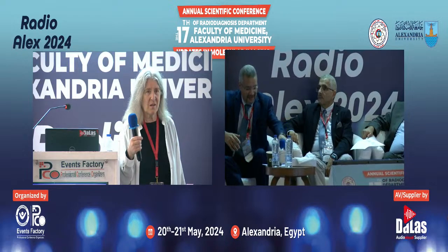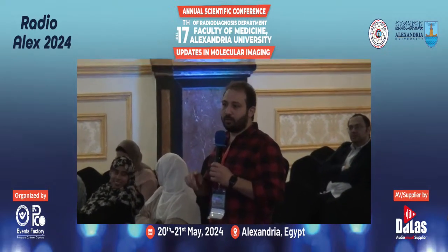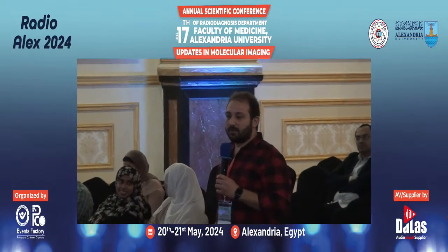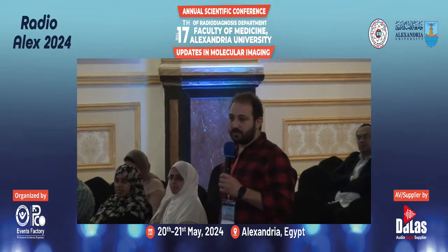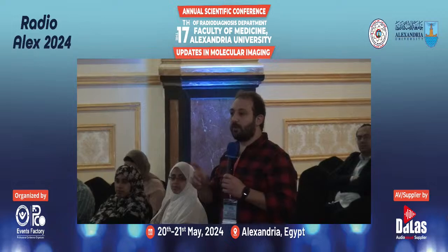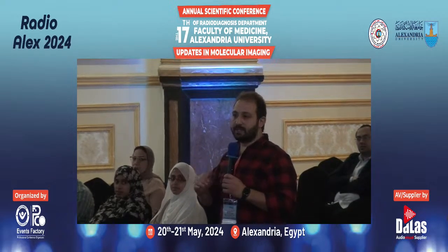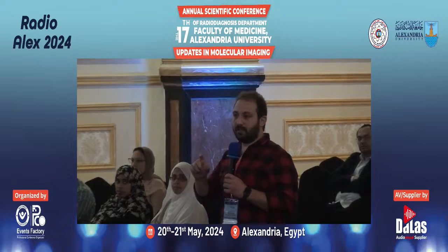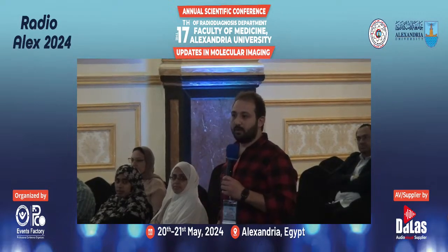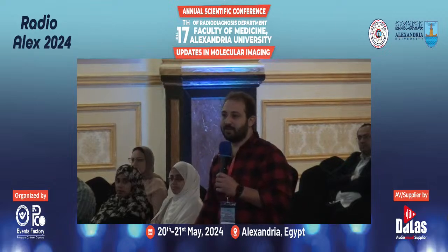What's your opinion about the delayed scan of the urinary bladder in urinary bladder cancers to eliminate the urine activity and detect small urinary bladder lesions? They sometimes do a delayed scan 2 or 3 hours after the initial scan on the urinary bladder alone, to decrease the urine uptake within the bladder and detect small urinary bladder lesions. So what's your opinion about this technique?